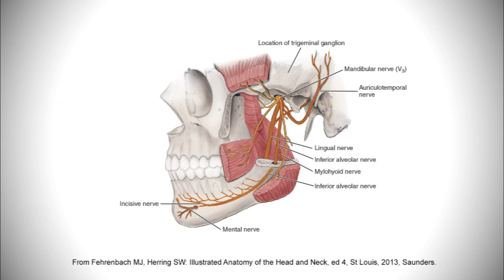If you want to ensure that the incisive nerve becomes numb, apply pressure to the mental foramen for 2 minutes after administering the local anesthetic. If you need to anesthetize the lingual gingival tissue, an IA block would be administered instead because the incisive block does not provide any lingual tissue anesthesia. You may also consider an additional supraperiosteal injection of the lingual tissue.